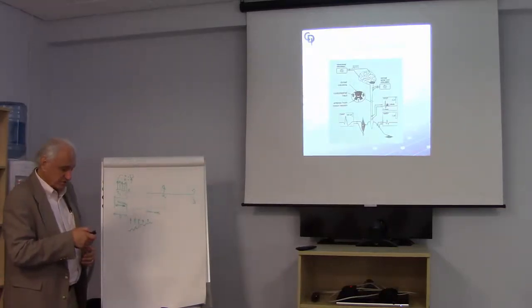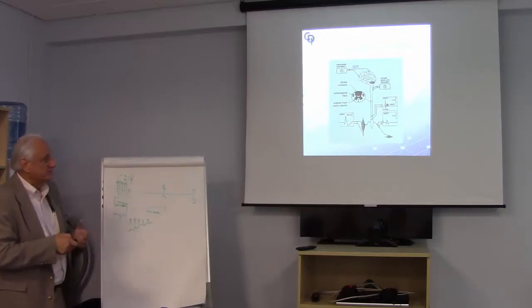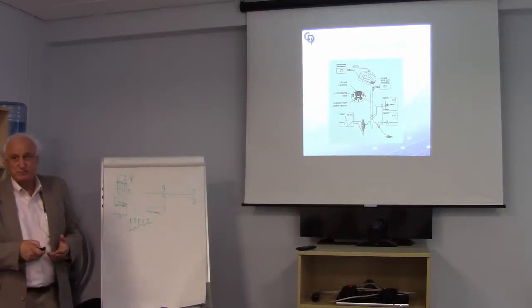This is just a general scheme, stimulating at the head, producing efferent activity, which can be recorded in 3 different ways: compound muscle potentials, compound action potentials through a peripheral nerve, and D waves, for our purposes, recorded directly from the spinal cord.